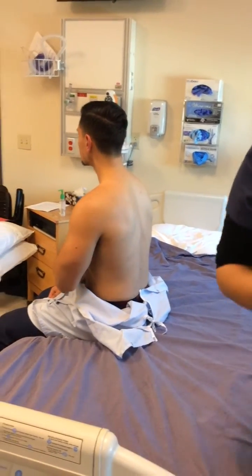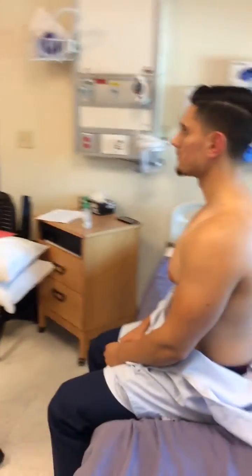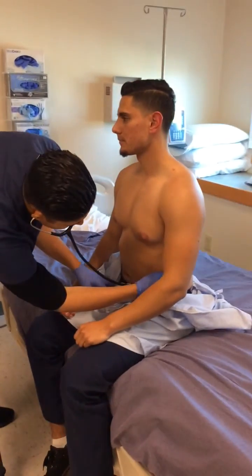You're also going to want to auscultate on the front. Again, you want to start at the bases. Okay, take a deep breath.